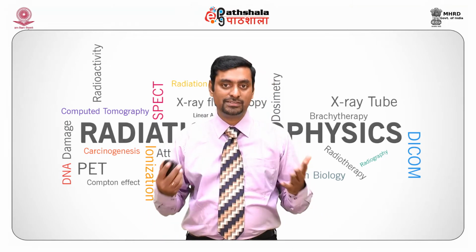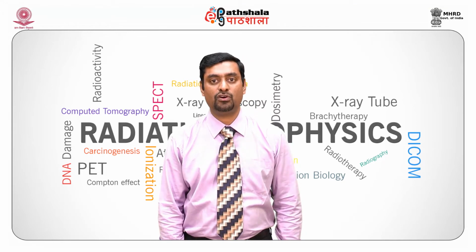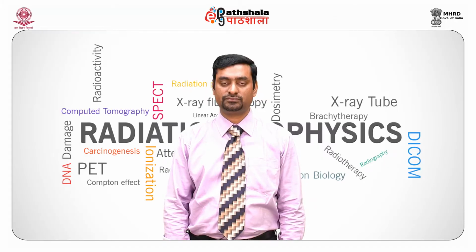The next component of the fluoroscopic imaging chain is the collimator. The collimator is similar to the radiographic imaging machine, except it has something called the iris, similar to what we see in a digital camera or an old manual camera. It is a device used to limit the X-ray beam falling on the patient. It consists of multiple sets of radiopaque shutters which can be made of lead. Proper use of this collimator can reduce scatter as well as improve image quality.